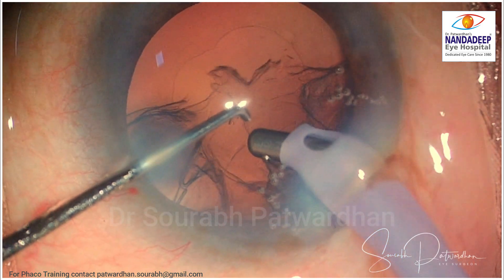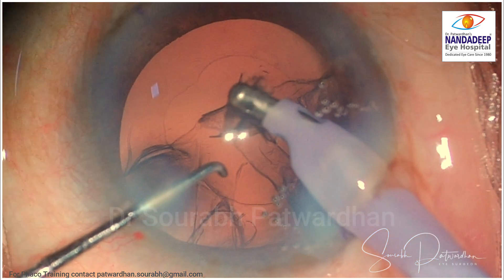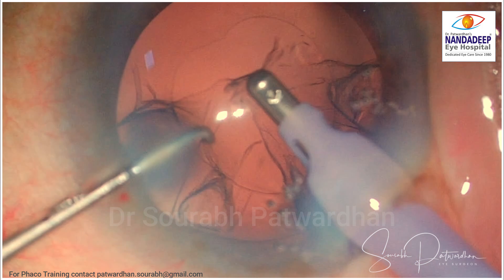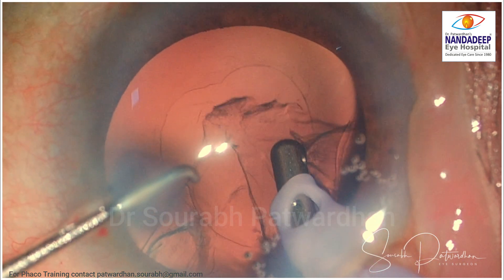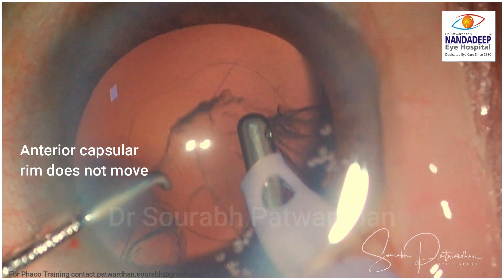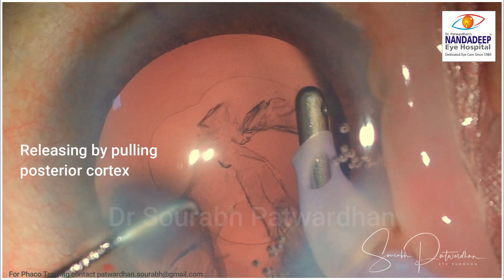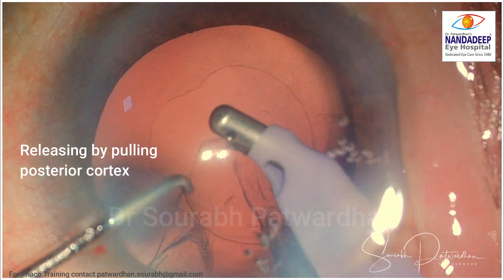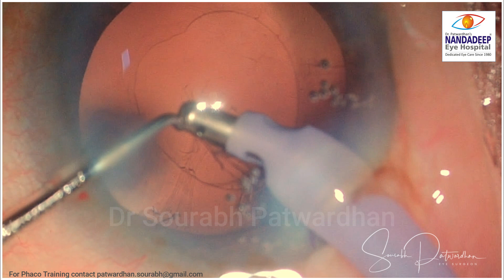I am going to take out the cortex from the sub-incisional region — again the same cortex peel technique to follow. Very gradual. We have to make sure the zonular weakness does not increase. The anterior zonular should remain intact. Very watchful and careful peeling of the cortex is what is needed. Very slow — let it release itself from the capsule. If the adhesion between the cortex and the capsule is strong, just leave it, put a CTR and then remove it. You can also grab the cortex from the posterior part of the cortex very carefully and pull it out. But for beginners I would say just put a capsular tension ring and then take out the cortex — that way it is safer.